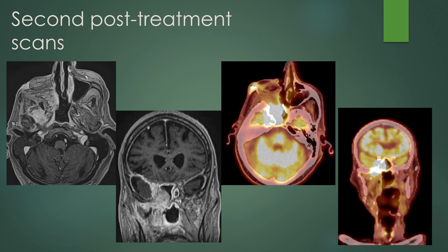On the short-term follow-up second post-treatment scan, that area has now declared itself. There is now mass-like enhancement posterior to the flap in the infratemporal fossa involving the pterygoid musculature, extending to the skull base and Meckel's cave. Thickening and nodular enhancement of the dura, extending into the sphenoid sinus, with FDG PET confirming abnormal uptake throughout the areas of abnormal enhancement on MRI. This is definite progression of disease.